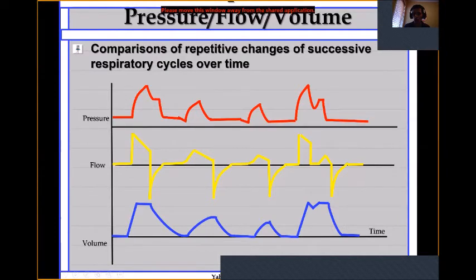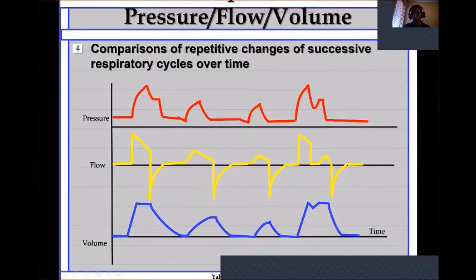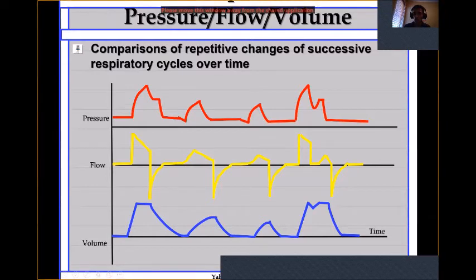So depending on the mode of the ventilation, you will know what is going on. And you can see the flow of the assisted ventilated breath, the flow of the spontaneous breath, and you have two types of flow. The machine and the patient are not coming at the proper time. And you can see also the volume gives you an indication of what type of breath. And remember, we have three types of breath. You have the spontaneous, you have the mandatory, given by the machine only, and you have the assisted. So these are very important to remember.